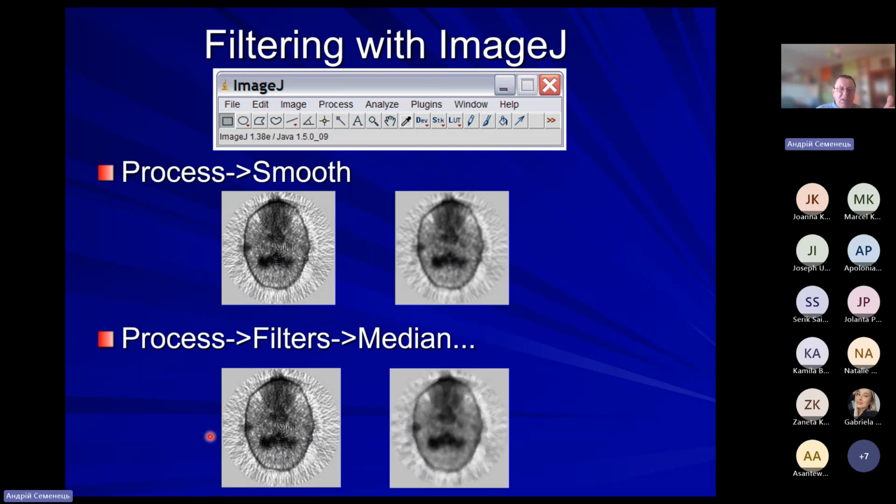In fact, every piece of diagnostic equipment which produces a medical image obviously has built-in features to perform filtering, let's say, on some predefined levels to make some basic adjustments. It's an obvious choice for a developer. But at this point, I'm going to talk about a universal solution, a third-party application, which is useful for image processing.